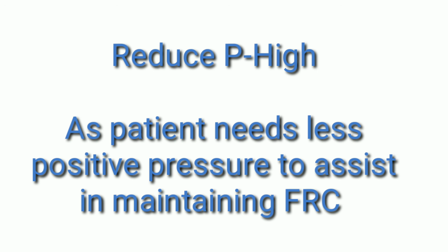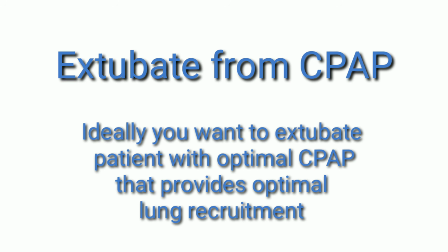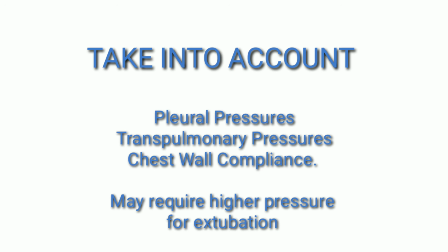Extubation can vary depending on establishments. Now I'm basing this on lectures of doctors that are using this, have used it, have done research with it, so they're quite proficient with it. Some I've seen can extubate on PEEPs up to 16. Others want to get them around 10 to 12. Now this is pure CPAP, no additional pressure support breathing above.